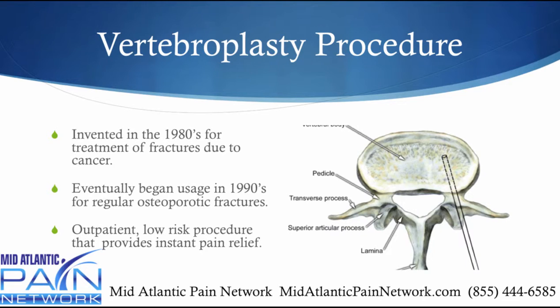So vertebroplasty procedure was invented back in the 80s, specifically for cancer fractures. Eventually, about a decade later, it started to get used for regular osteoporotic fractures because it works so well. It's an outpatient procedure, it's very low risk, and it provides typically instant pain relief.